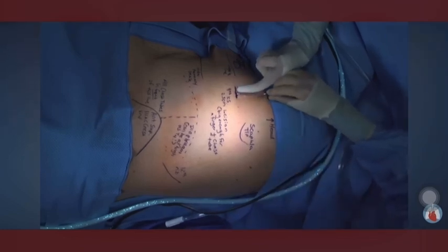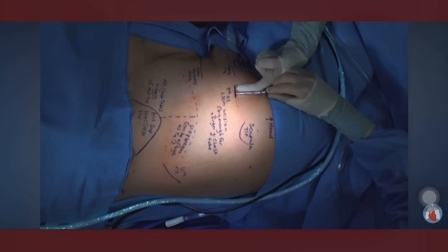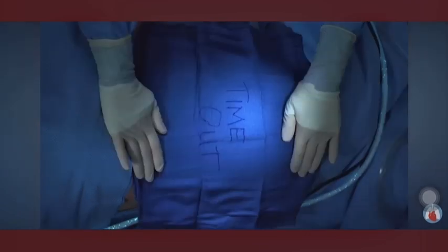Note that our incision is going to be approximately 2.5 centimeters, maybe a little bit larger in some patients, to allow careful insertion of the chest tube. The timeout is essential. Verify your patient, laterality, that you have all of your equipment, and that you have adequate help in the room. This is a point at which you can have your assistant start setting up the atrium.